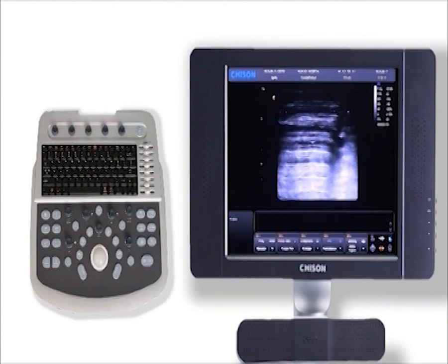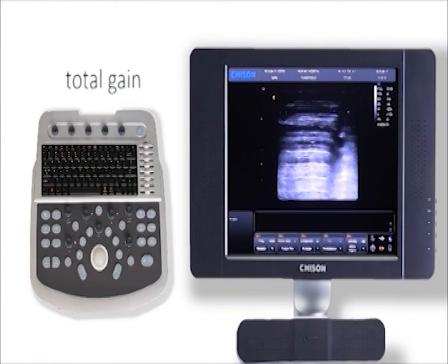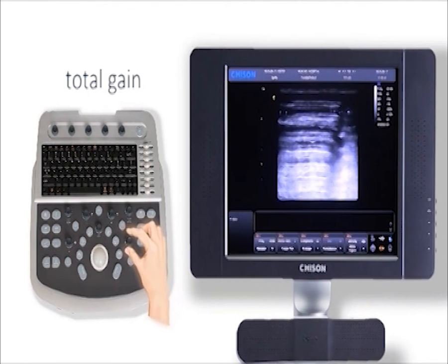In B-mode, four parameters are the most important: gain, depth, frequency and focus. Firstly, gain control consists of total gain and TGC. To adjust total gain, rotate the B knob to increase or decrease gain.